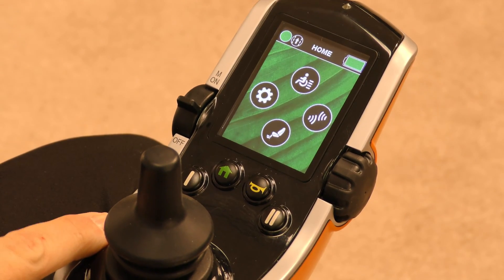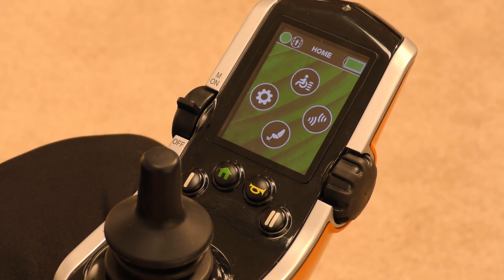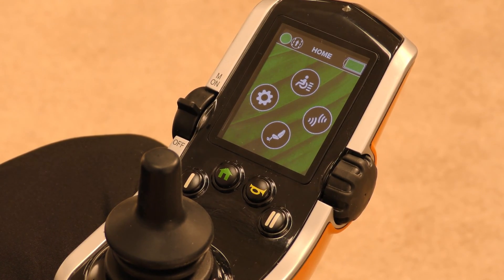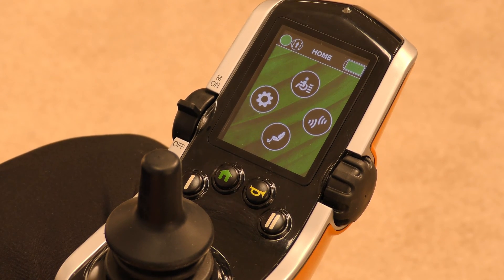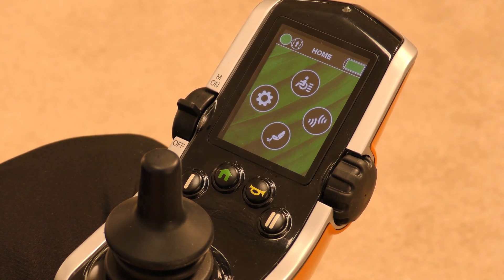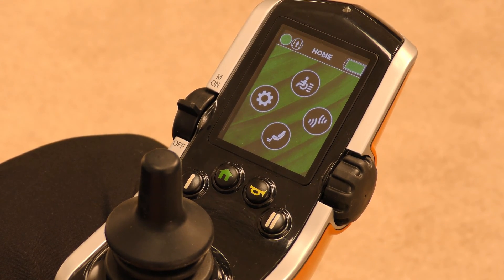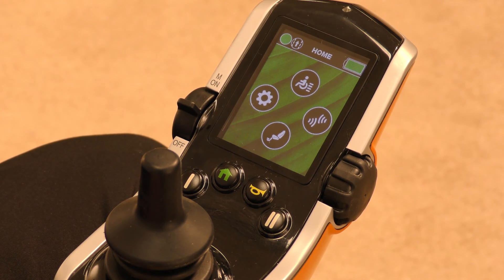In addition to the new home button, we also have the ability to program the one and two buttons for power seat functions, light functions when a light package is available on the chair, mode functions, a home function, and mouse clicks. Q-Logic 3 provides the ability to truly customize the chair to the individual — for example, if an individual cannot give a mode command, we could program the one or two button as their mode button.